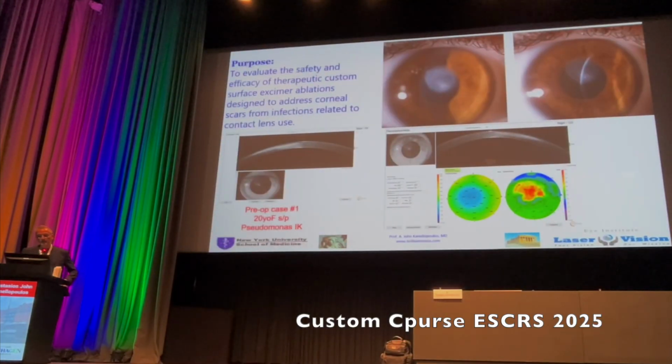So in this case series we presented, we're looking at some very serious scars, mainly induced by contact lens use. You can see here how dense the scar is. You can see how deep it goes into the cornea. This patient is contact lens intolerant now, especially after she had to go through all this. And again, maybe a missed opportunity by the clinicians who treated the ulcer to switch over to adding corticosteroids.